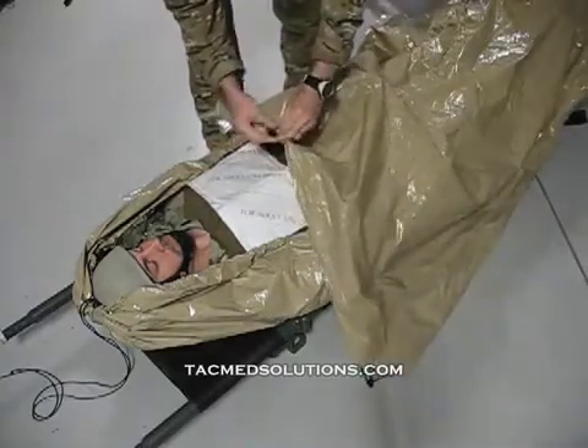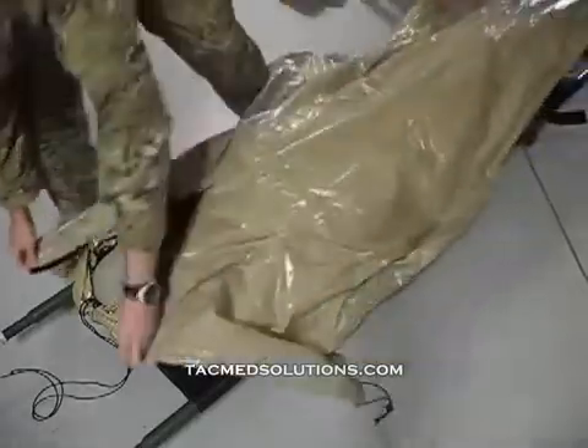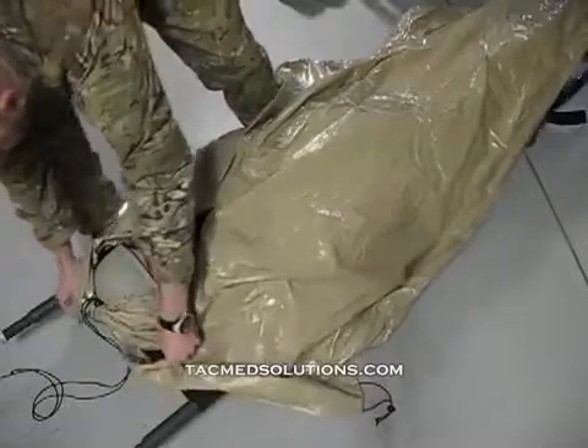To secure the blanket to the casualty, a portion is opened and wrapped around the casualty's head. It is then reconnected underneath the head.